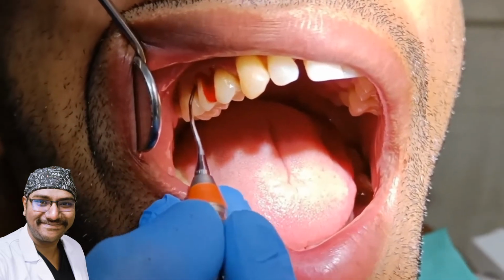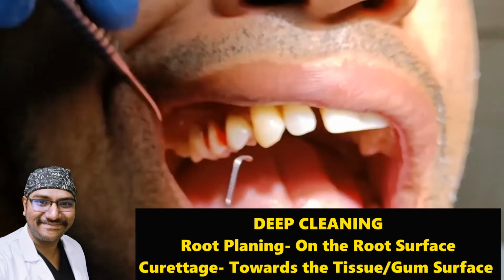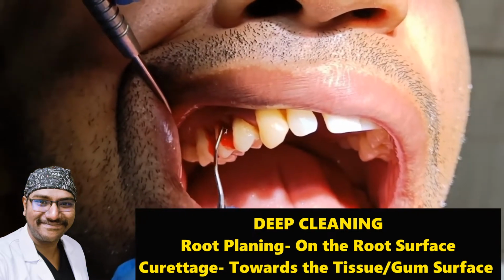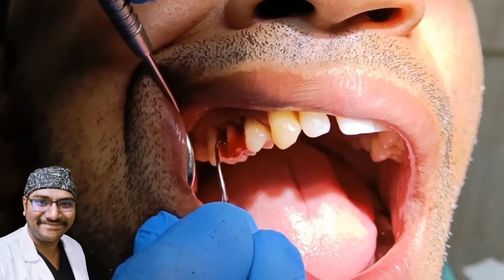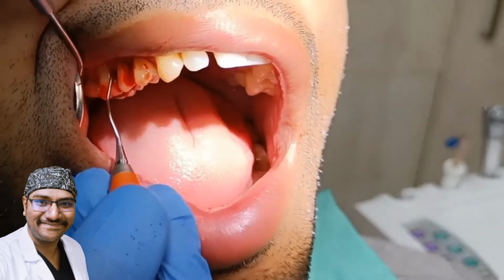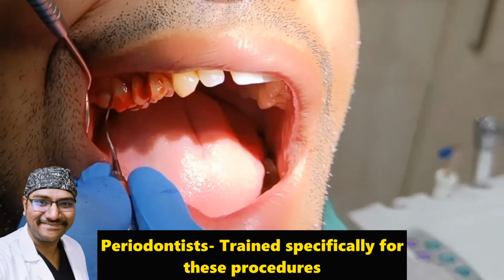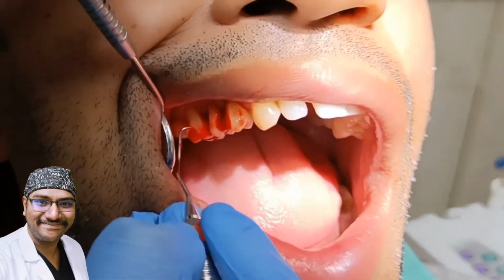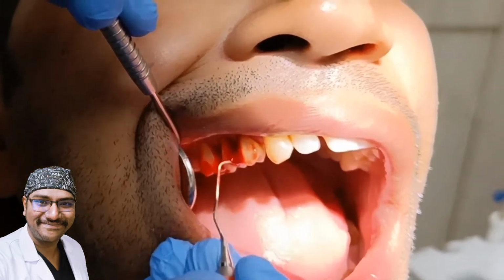The following section of the video shows what is known as root planing and curettage. Now these are collectively called, for the patient's knowledge, deep cleaning. This is the interim step between the surgery and the normal superficial supragingival and subgingival cleaning. Basically, we are taking out all the infectious tissue in a blind procedure, thereby making sure that all the excess granulomatous tissue before surgery is taken out and the infection load is actually reduced.